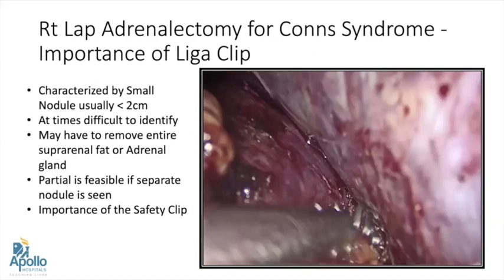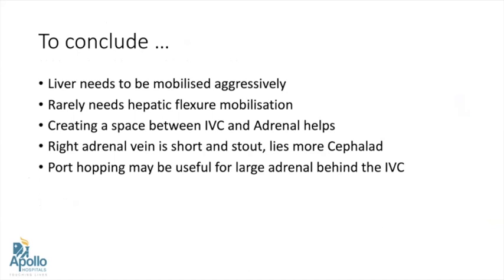To conclude, in case of adrenalectomy, the liver needs to be mobilized aggressively. We rarely need hepatic flexure mobilization or duodenal mobilization on the right hand side. Creating a space between the IVC and adrenal helps. The right adrenal vein is short and stout and it lies more cephalad than we actually think. Port hopping may be very useful especially for the large adrenal gland which goes behind the IVC. Thank you very much.